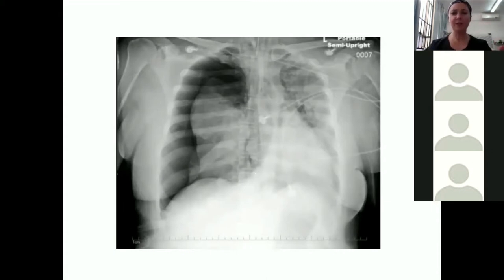A couple of folks said, could this be pneumonia? I mean, obviously on the right-hand side, your patient's been stabbed, but interestingly on the left here, that lung field looks like there's a lot of opacification there. I wouldn't be surprised if this patient's unlucky and got pneumonia as well on the left-hand side. It's not the greatest x-ray, but definitely a pneumothorax on the right-hand side. I can't wait to put in a chest drain on this patient.